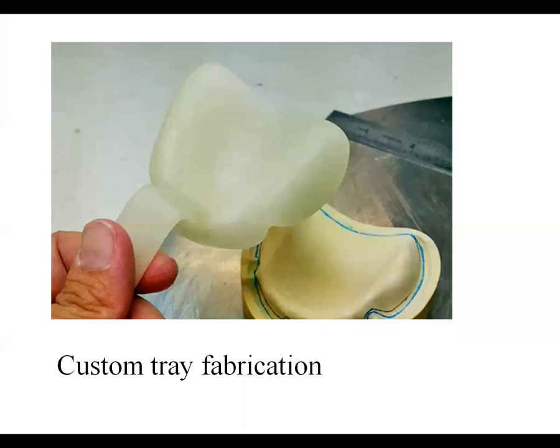It should be at 45-degree angulation, and in this diagram they are showing that this handle is in a horizontal direction. What happens if we prepare a handle like this? It will interfere in your anterior maxillary vestibule area. It will interfere with your lip. And why do we give 45-degree angulation?